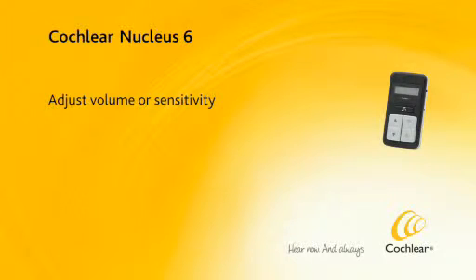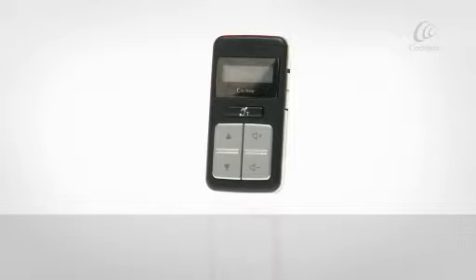Adjust volume or sensitivity. Usually, your clinician will set up your remote control to adjust the volume of the sound you hear. But your clinician can instead set it up to adjust sensitivity.